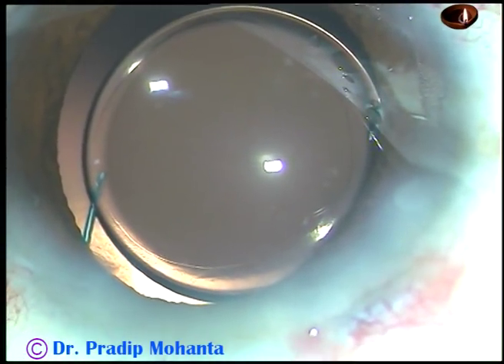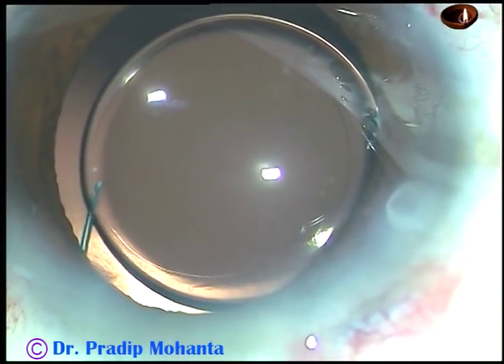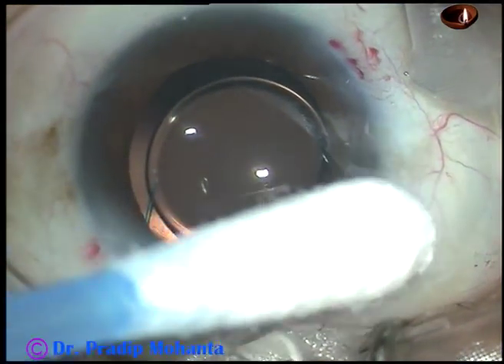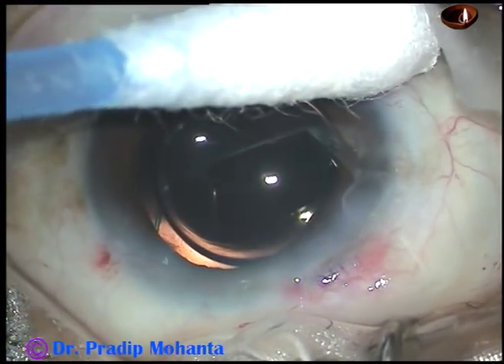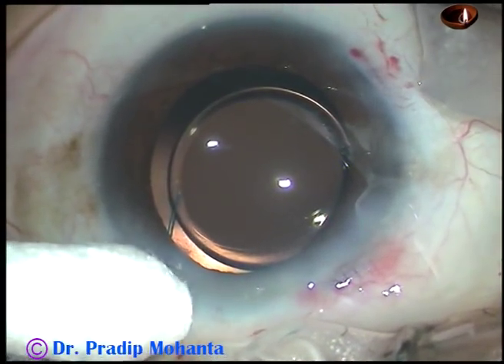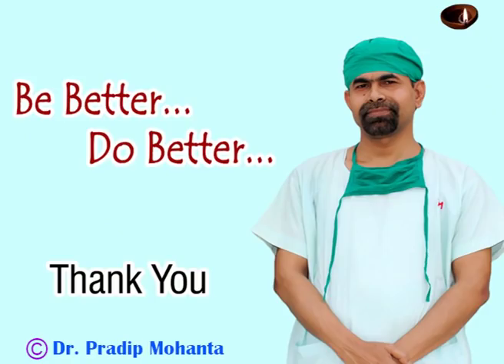The integrity of the wounds is checked — there should not be any leakage from any site. When I am satisfied, the case is concluded. Thank you very much for your attention. Hope this video will help you in developing your surgical skills. Be a great surgeon and serve mankind with love, respect, compassion, and great surgical competence.